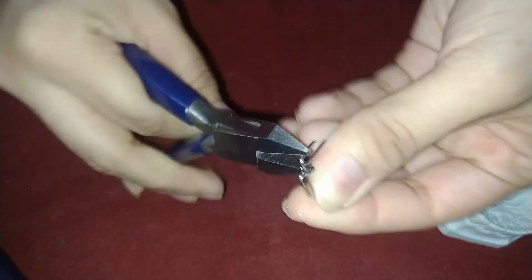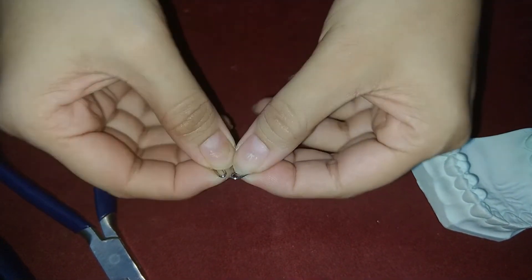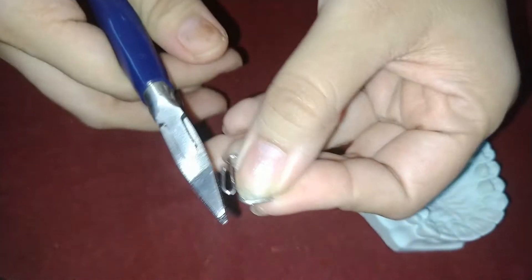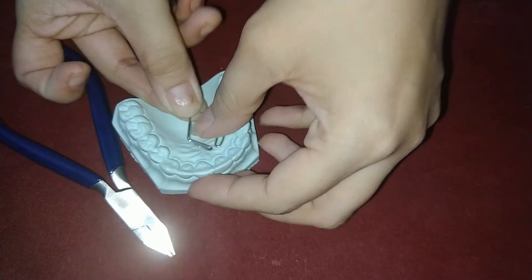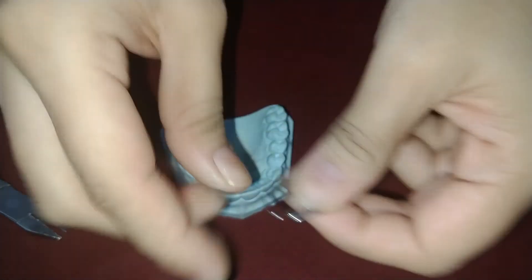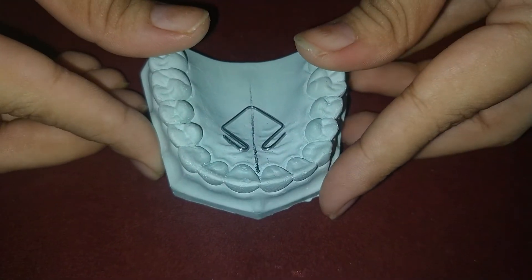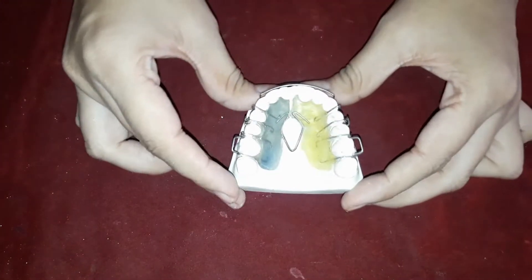Now our spring is finalized. This is how the well adapted coffin spring should look like. This is the acrylized plate of coffin spring.